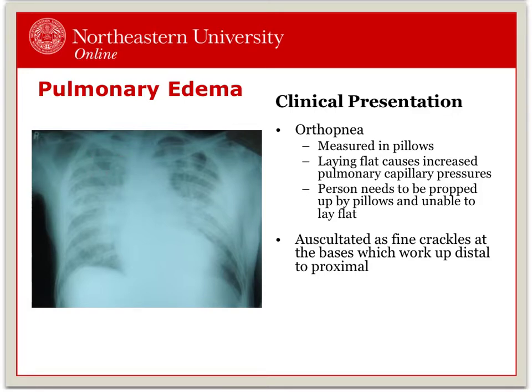This patient has extensive disease and would not be appropriate for physical therapy. Both the current weight and the dry weight, as well as the extensiveness seen on the image, would guide appropriateness for treatment.